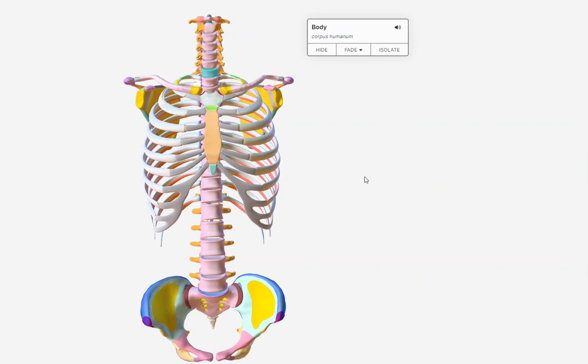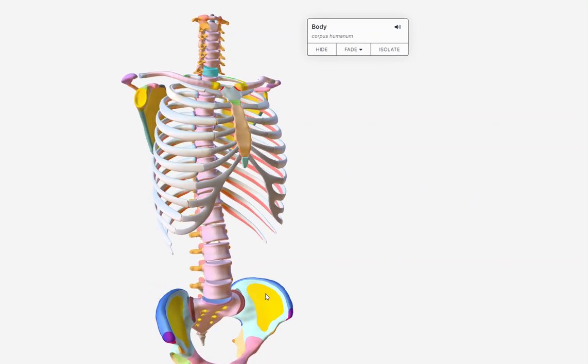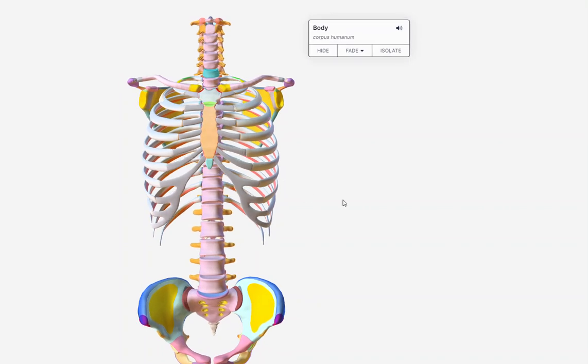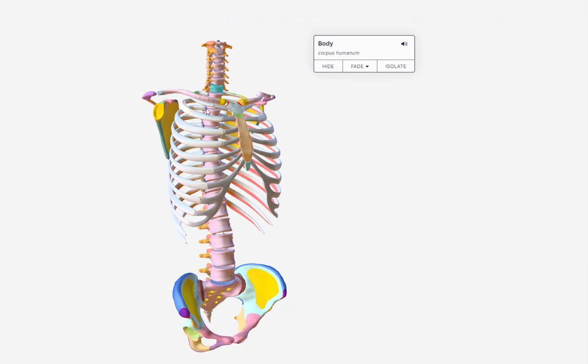Okay, also, let's do a little bit of rotation and look at what's happening at the ilium real quick before I end this video. So down here at the ilium, we can follow elongation of the ilium as we rotate the patient here. So if you notice here at the ilium, we get elongation. This position is what? AP projection, left side rotating towards the IR, LPO position.